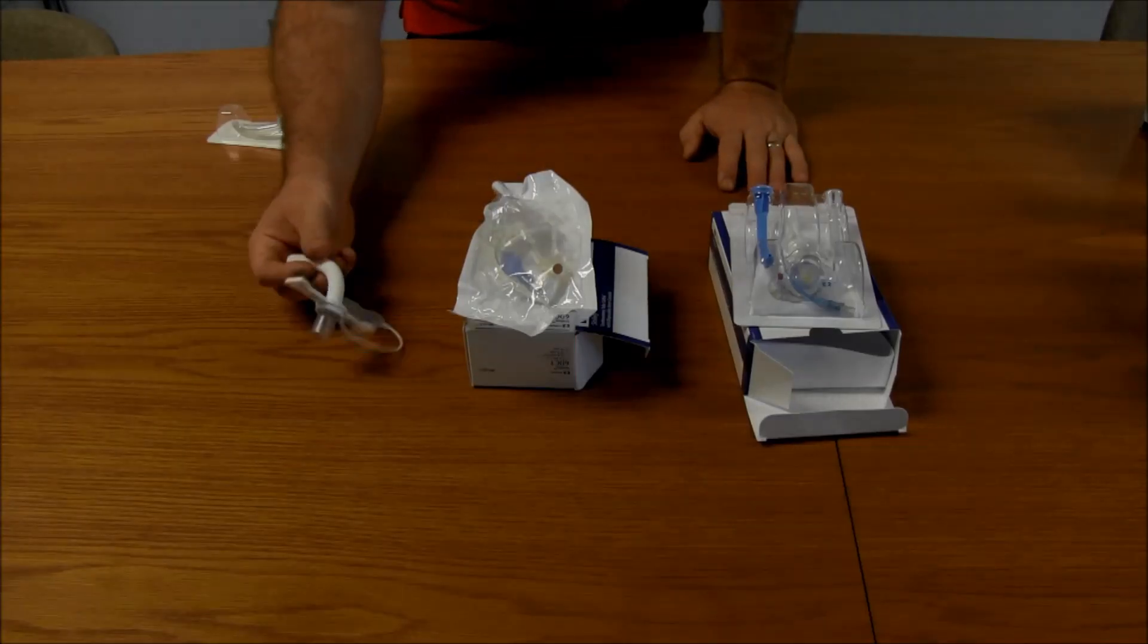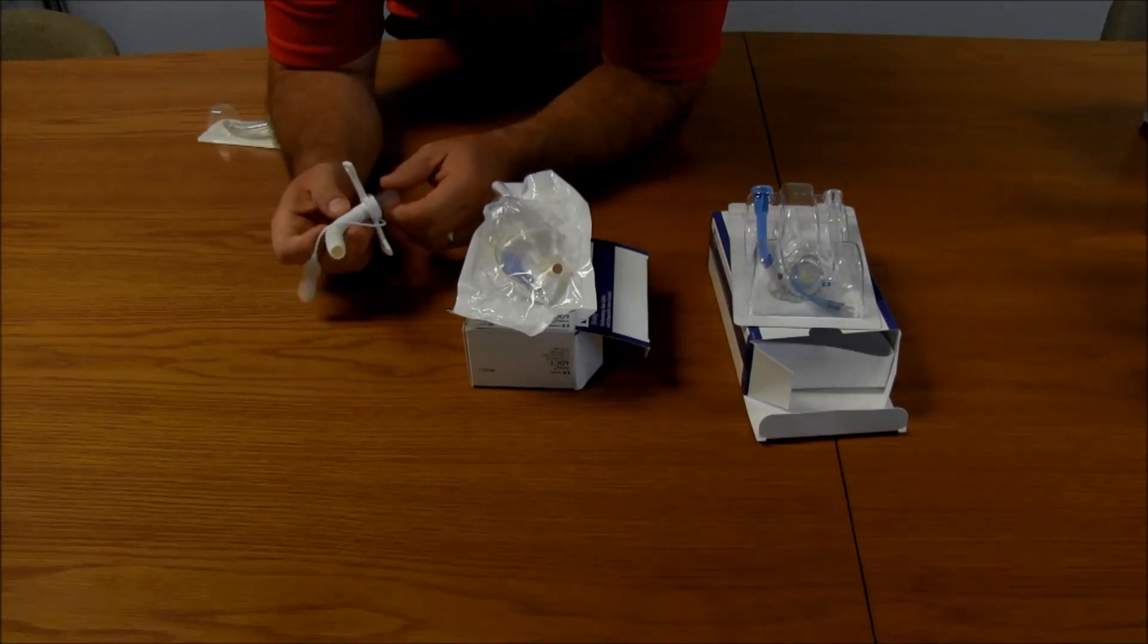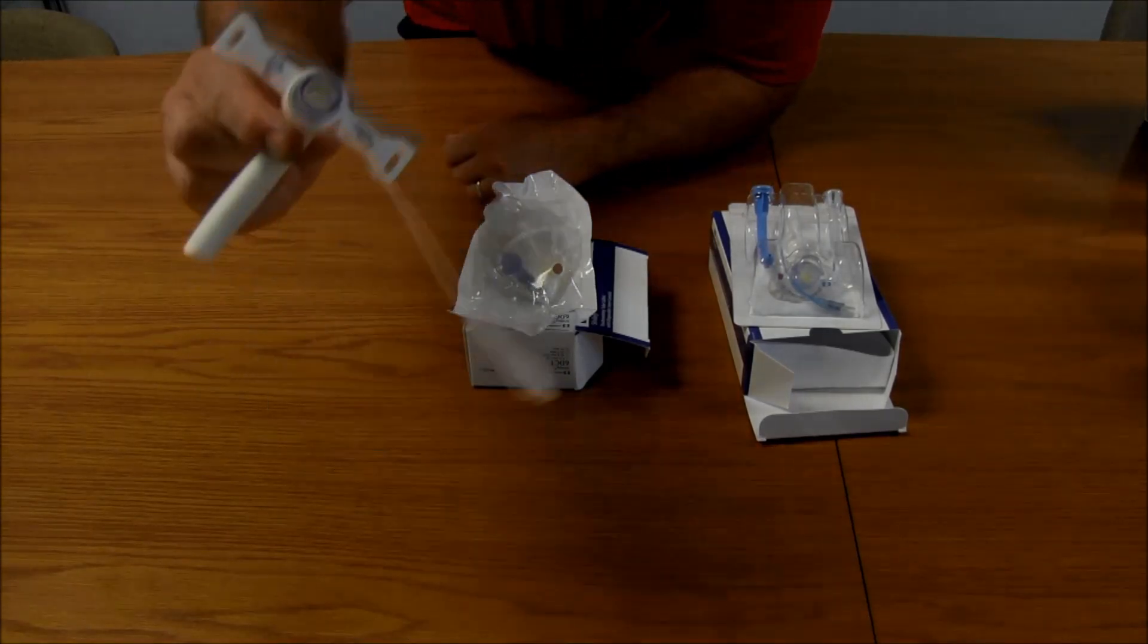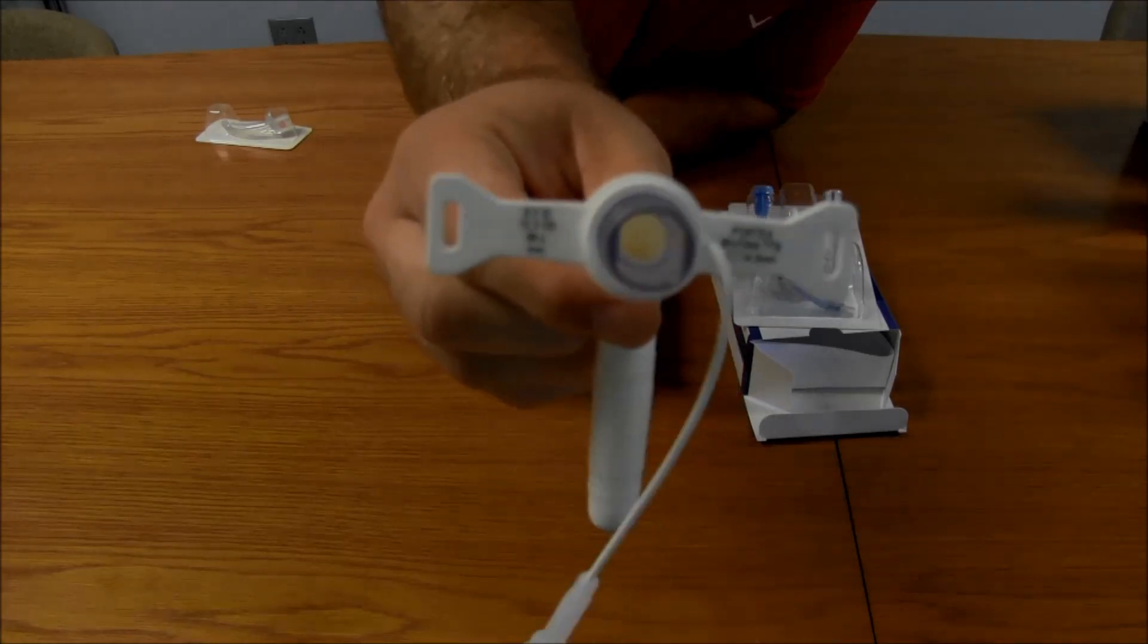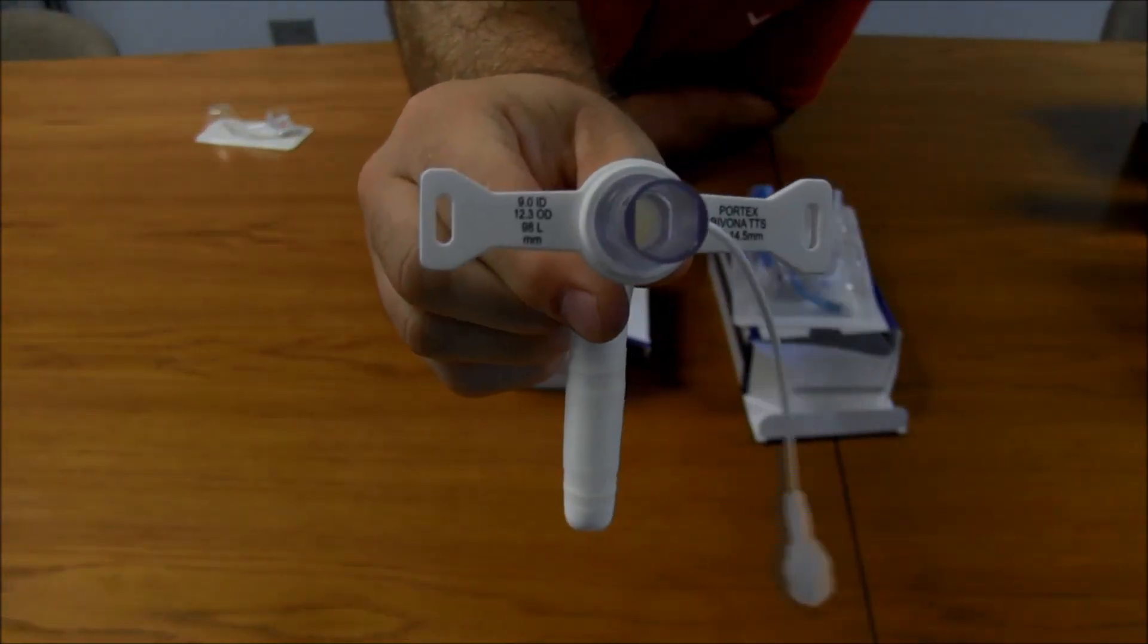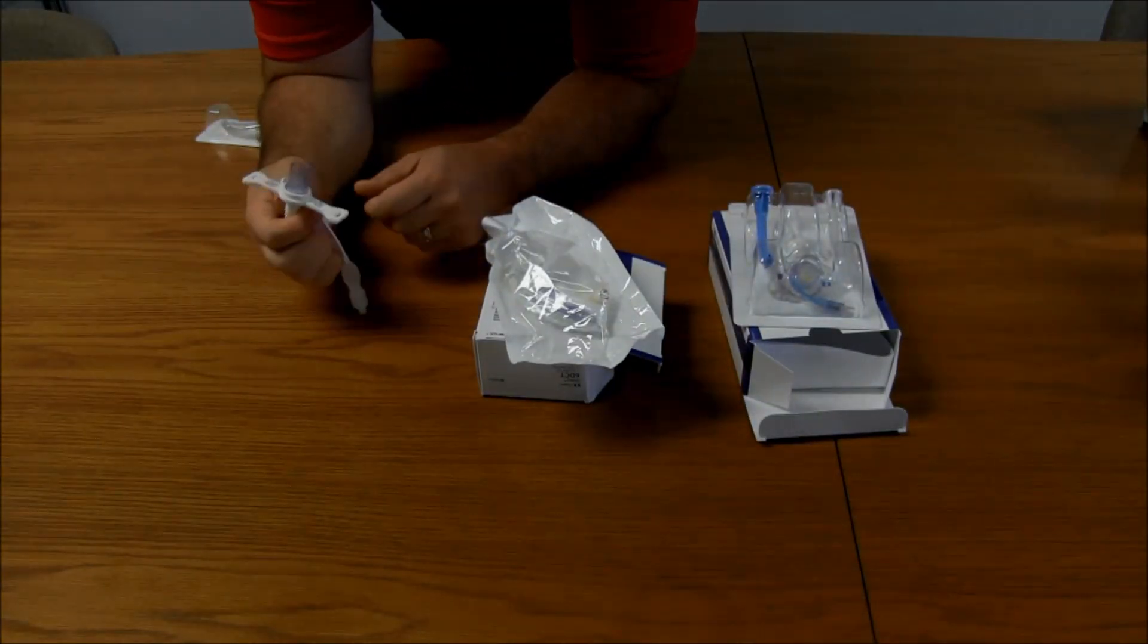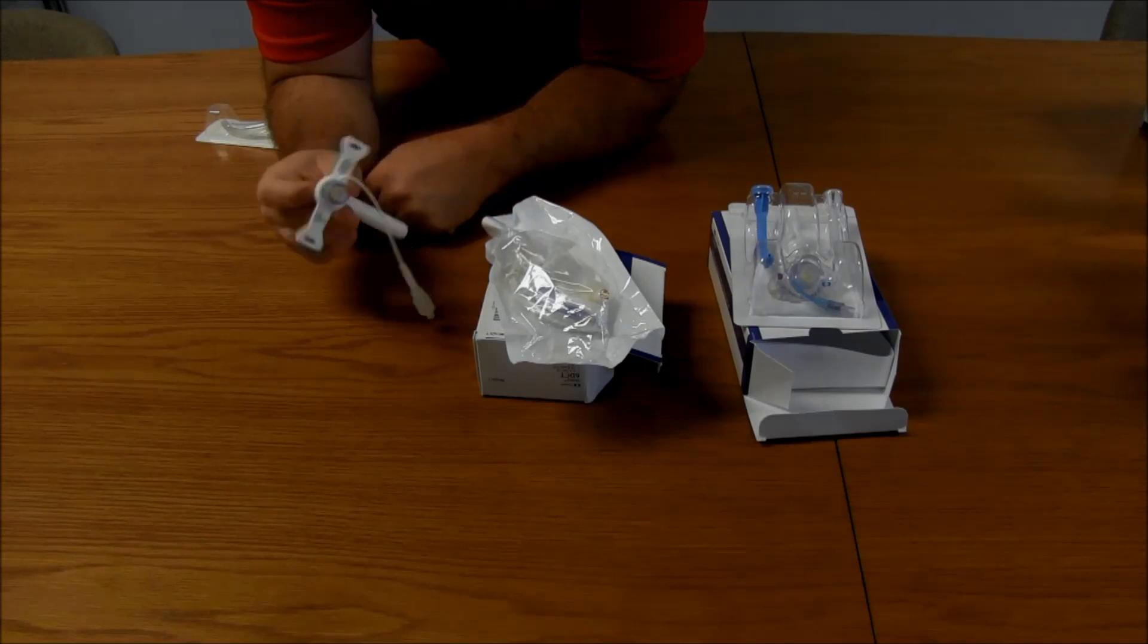So I have all three types of trachs here. Of course, this is the Portex Bivona that we're used to. This is an extended one. You can see that it is a 9.0 inner diameter. And this is a fixed flange. So the flange is fixed. It does not have an inner cannula on it.